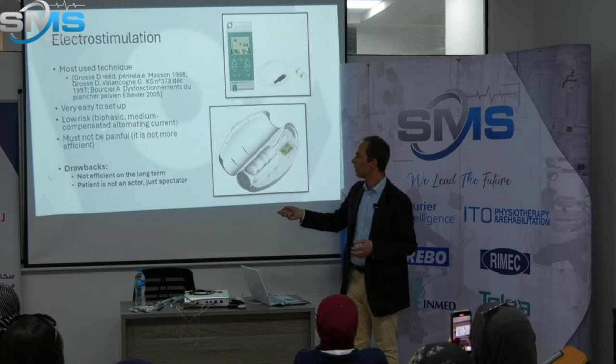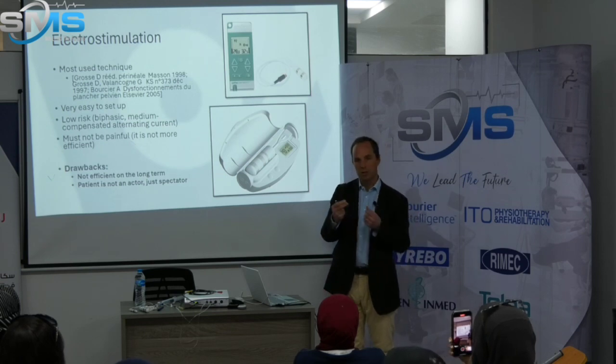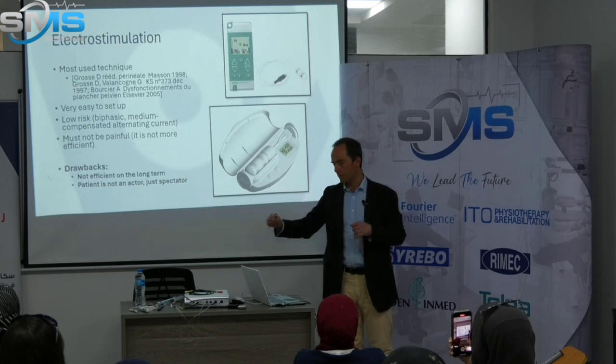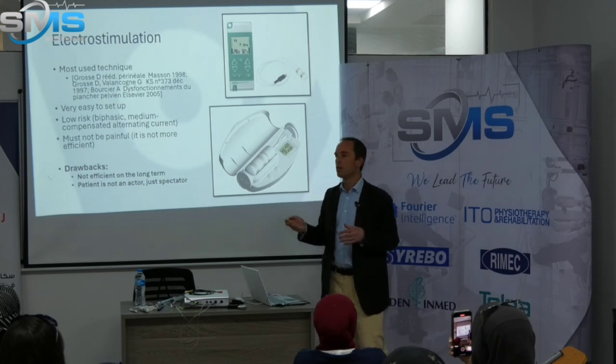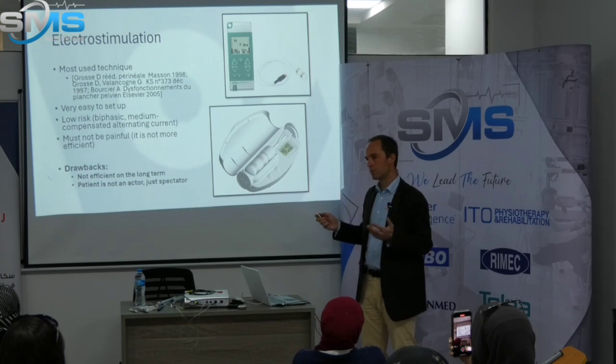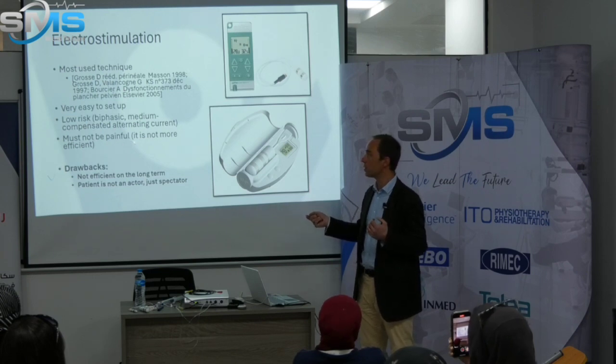One very important point, it can be scary for some people to have some current sent to an internal probe. So you have to talk a lot with your patient so that she's confident with this technique. And one important point is that it must not be painful.